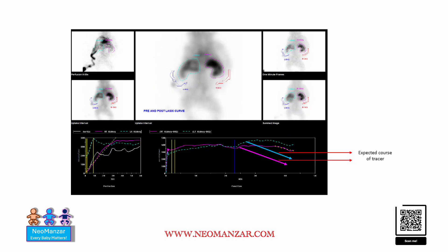Let's look at the bigger picture here. As you can see, the dye is given with good uptake. There is some problem with excretion, and as you can appreciate, this is the projected excretion curve after an hour of Lasix or diuretic. But this patient is not excreting — both kidneys are holding on to the dye.